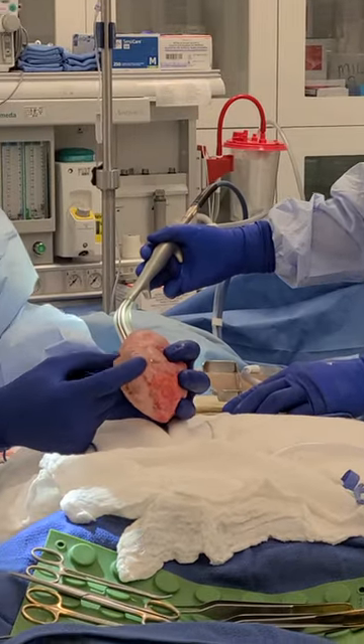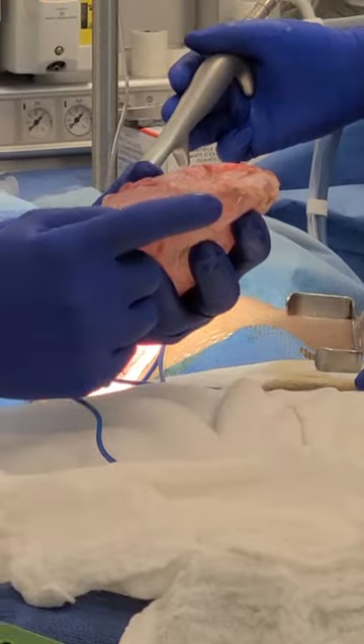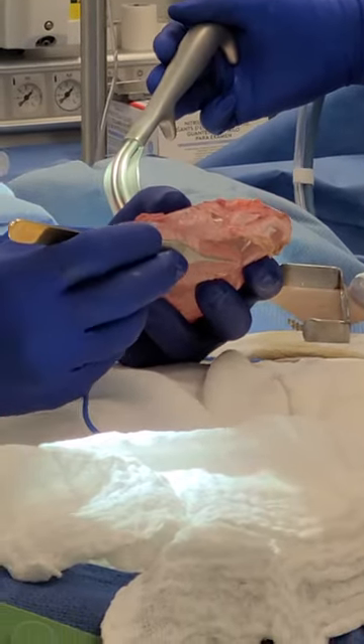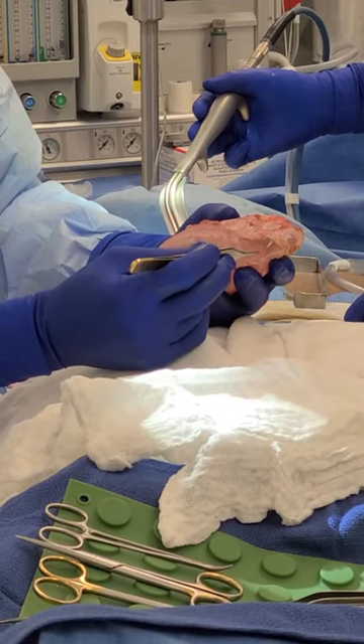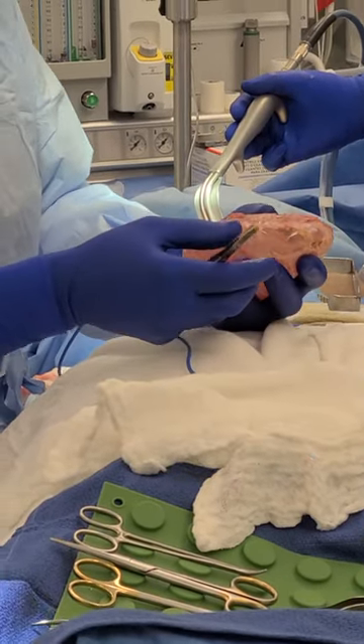When an implant is folded like this, from an engineering standpoint, this makes the implant more apt to fail in this area because the implant wasn't designed to be folded like this.